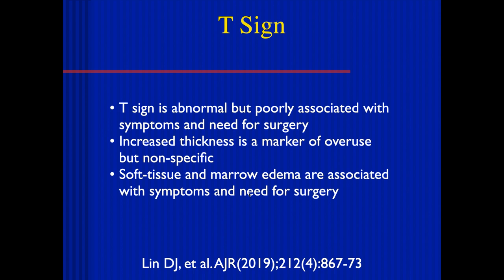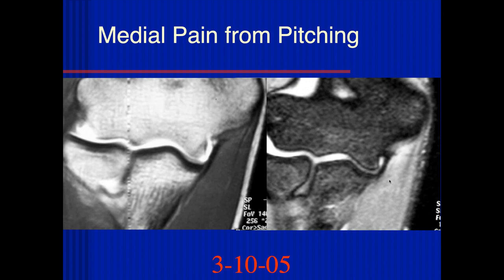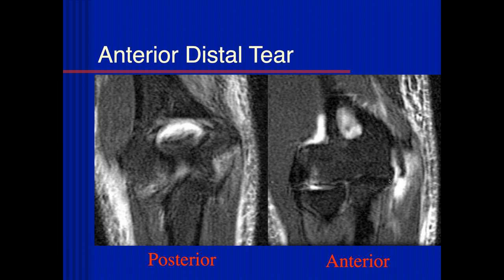Soft tissue and marrow edema are associated with symptoms and a stronger need for surgery in these patients. Here we can see the attachment of the ulnar collateral ligament to the sublime tubercle is completely avulsed off, and there's a complete tear. When you see something like that, it's conceivable you can reattach it, but that's probably pretty rare, because the reconstruction is so good.